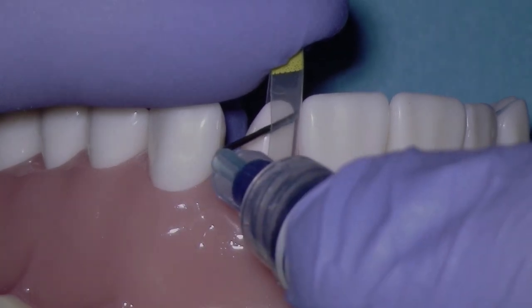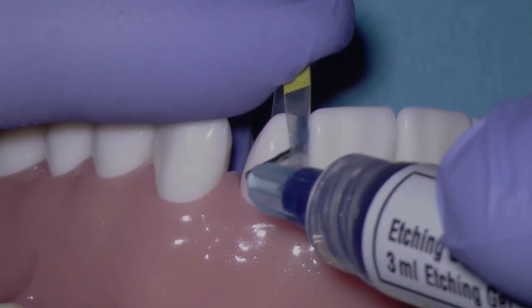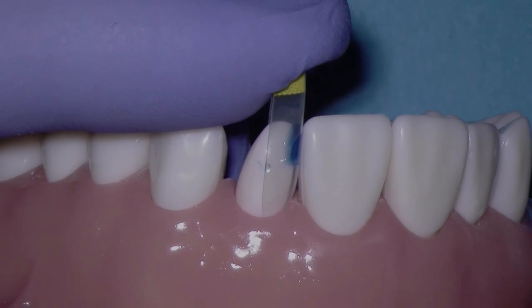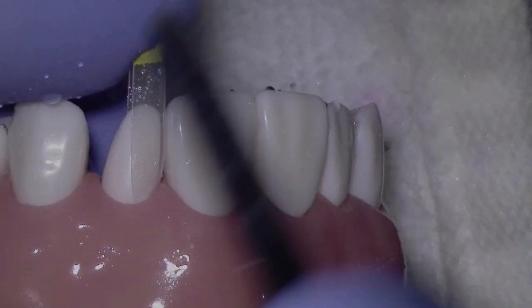While I'm holding the matrix in place, I'll come in with the phosphoric acid and we're going to etch this area generously. We're going to etch about twice as much as the actual area of the adhesive. We want to make sure that the area is very well etched. Now I'll go ahead and rinse that away after etching for 15 seconds on enamel.